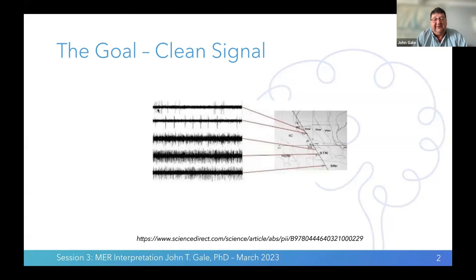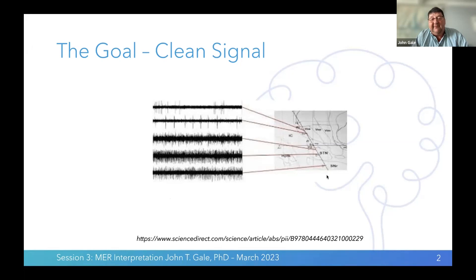We can see different morphologies even within the same trace — one neuron looks different from how another fires. This is a trajectory used in deep brain stimulation. As we go down through the brain, at the top of the thalamus you can see a particular firing pattern, and a little deeper in the thalamus it has its own specific type of firing pattern.